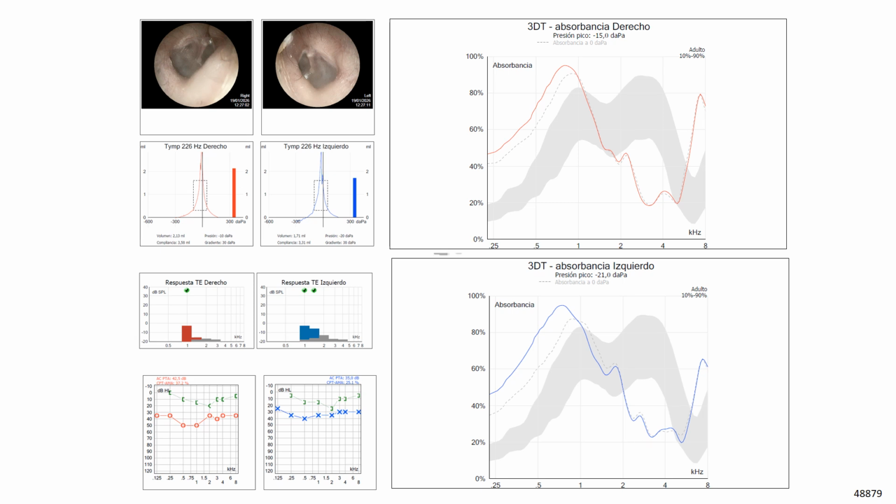There is also high absorbance at low frequencies. This happens because the ossicular chain is no longer connected. The normal stiffness is lost. The balance between mass and stiffness is changed. The resonance frequency moves down. This creates a peak at low frequencies, where sound energy is trapped instead of going to the cochlea.